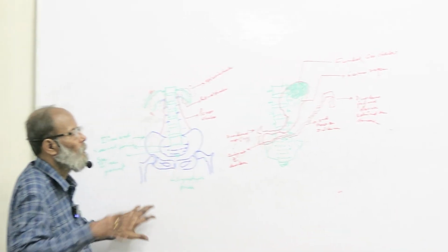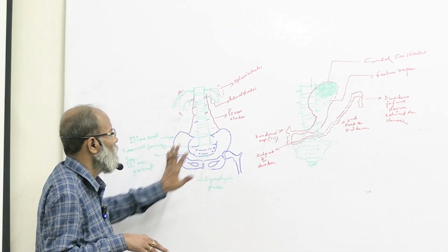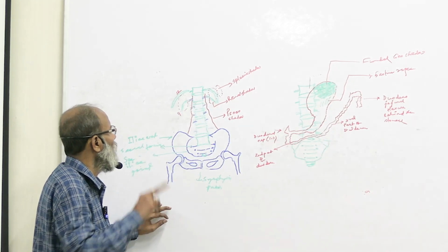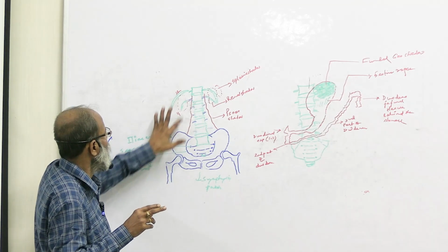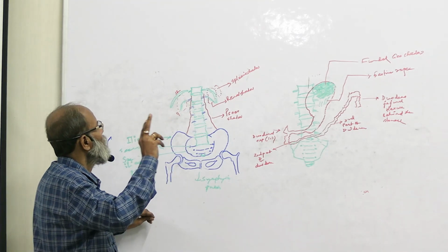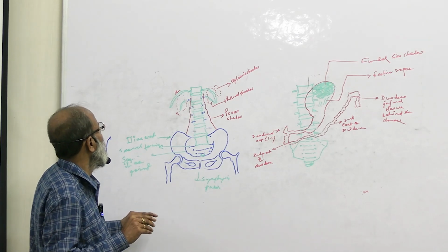This is the iliac crest. This is the sacrum with anterior sacral foramina. This is the symphysis pubis. Alright. Above you can see the lumbar vertebra, the psoas shadow, the impression of the kidney and the splenic shadow. This comes in the straight X-ray abdomen.